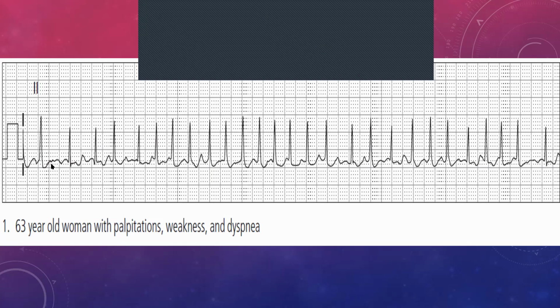So just to show you how analyzing those 5 aspects of the rhythm can actually make life easier for you. In both, let's just say an AFib and an SVT, both don't have P waves. In both, you can't talk about a PR interval. In both cases, you can't say a QRS follows every P, but in both of them, the QRS complexes are narrow.